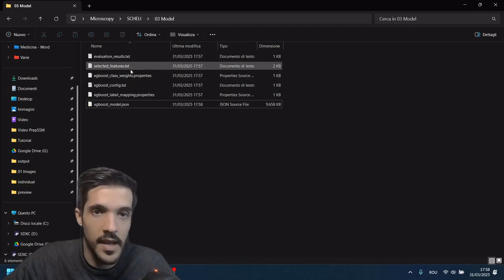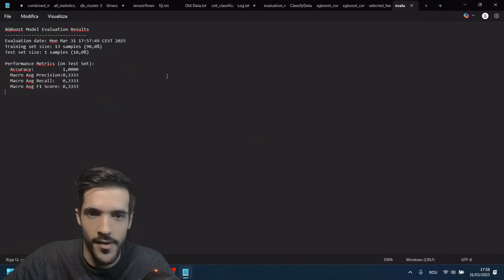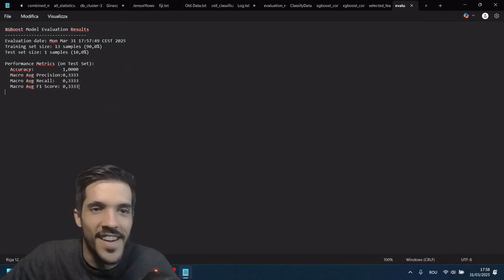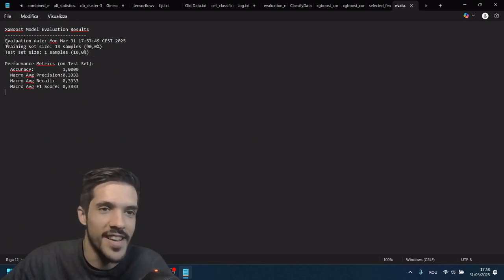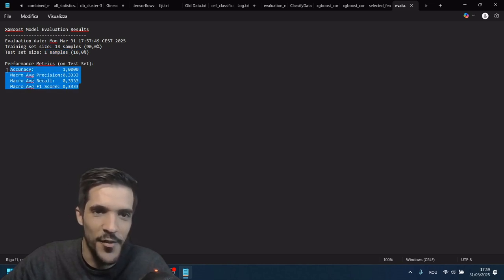we also have some results. So let's see how well did it do. Well, not that great, since we only selected a few cells. So as you can see, the training set was 13 cells. It was tested on one cell, and so yeah, it's not great at precision, recall, or F1 score.